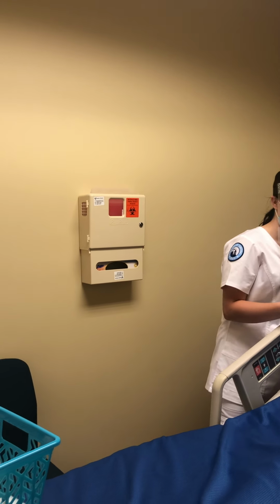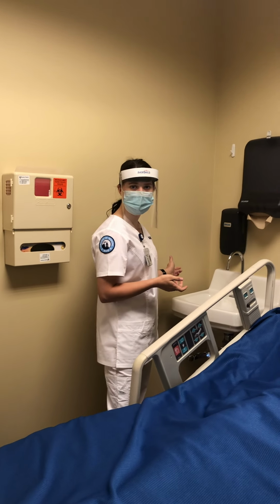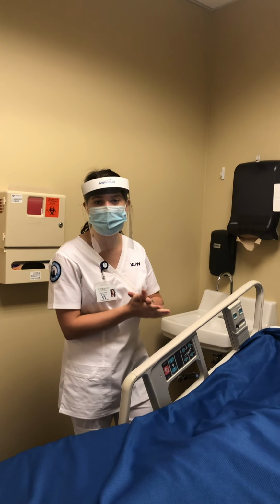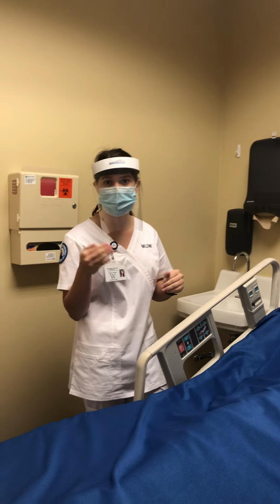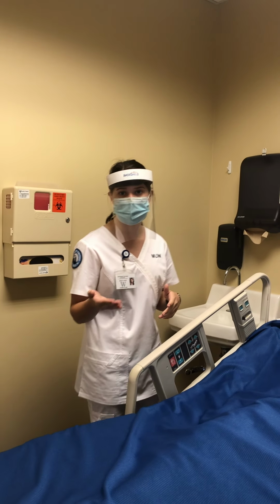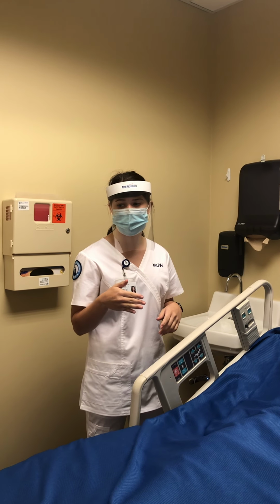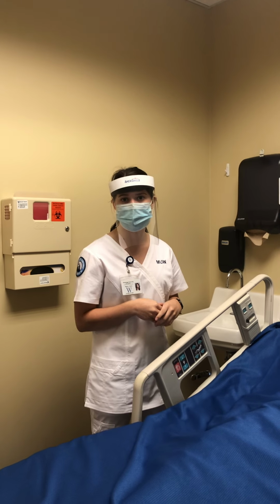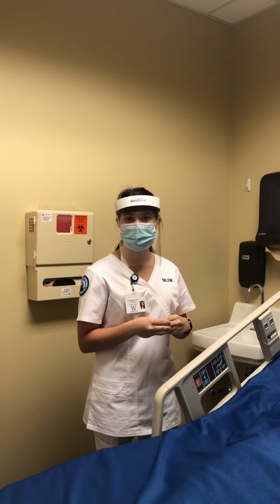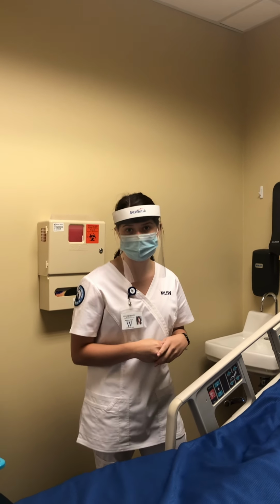their hospital wristband. Then I'm going to use an antiseptic hand sanitizer, and while I'm ensuring that it is completely dry to ensure the complete antiseptic effect, I'm going to explain to the patient why we change bed linens. We change bed linens to ensure no further illness comes to the patient, like bed sores or skin irritation, and just to keep them clean. We don't want them laying in soiled linens, to keep them as comfortable as possible.